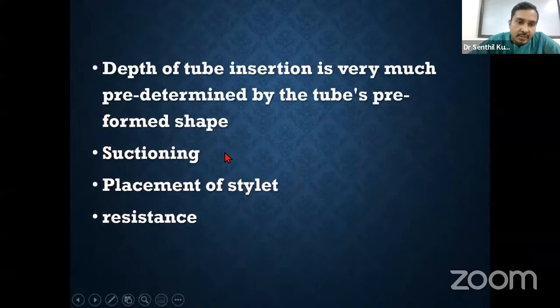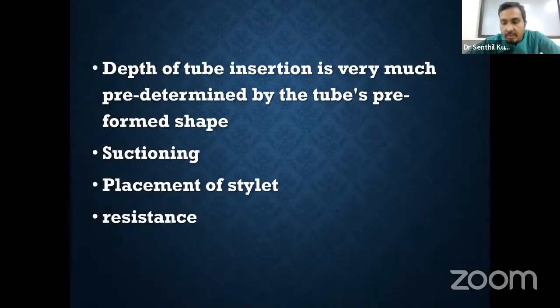The other disadvantage is that since there is a preformed curvature, suctioning is going to be difficult. Placement of a stylet is going to be difficult. And when the procedure ends and the patient is breathing spontaneously, it is going to increase resistance and increase the work of breathing.